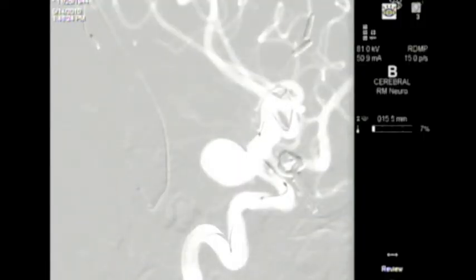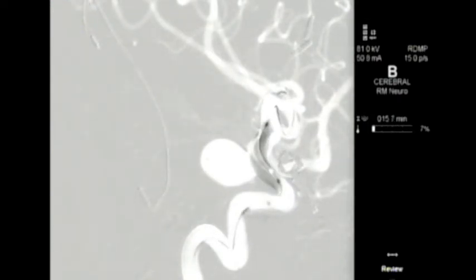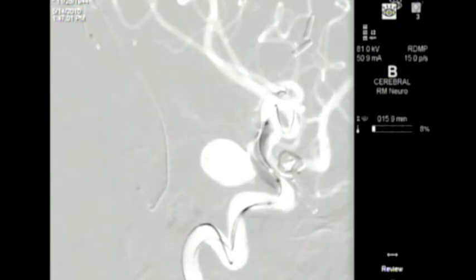A balloon is inflated across the neck of the aneurysm within the intracranial carotid artery. The purpose for this balloon is to seal off the neck of the aneurysm and keep the coils inside the aneurysm and prevent them from herniating back inside the normal carotid artery.